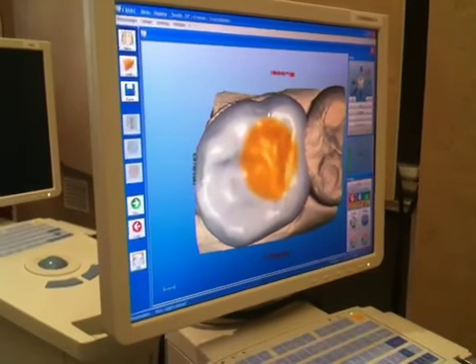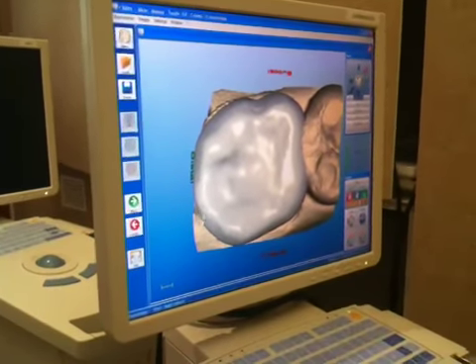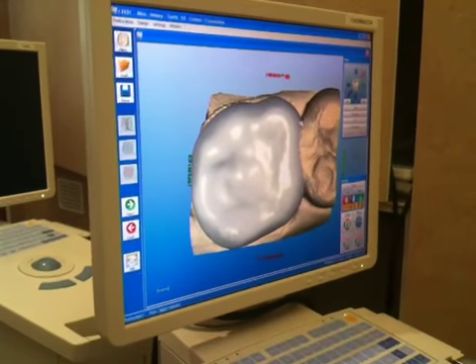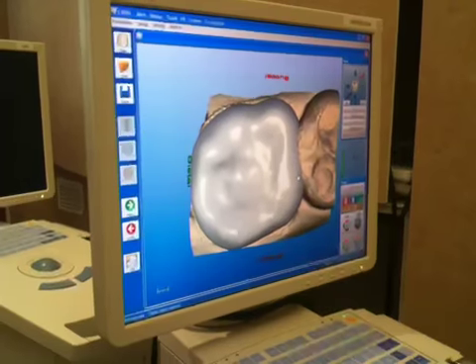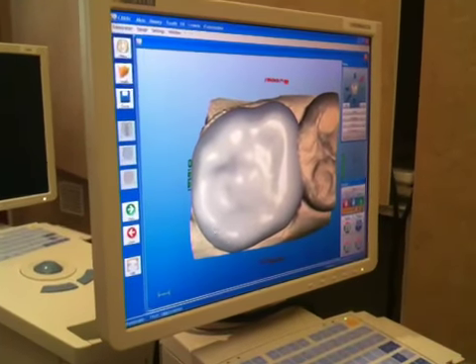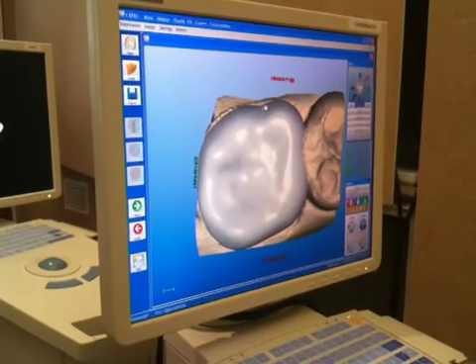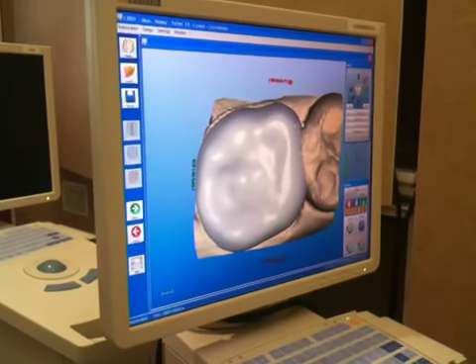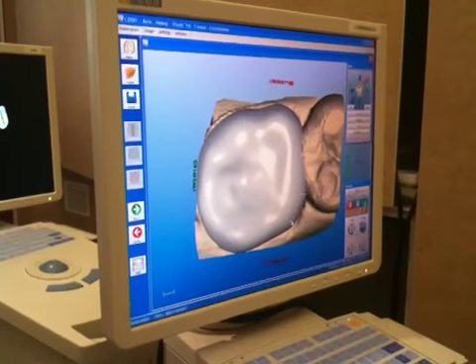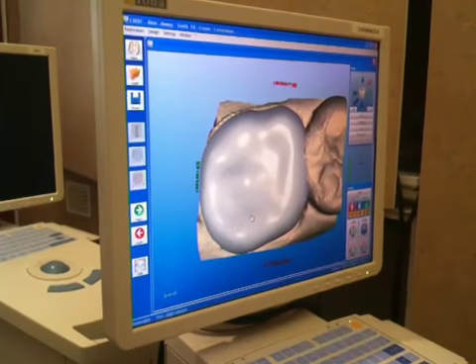So now this yellow area just tells me how big of an area I'm going to be adjusting at once. And now what you're seeing in front of your eyes is that I'm smoothing the tooth off. You notice that it looks like it's enveloping a portion of this other tooth, which just basically means that we haven't gone into it too much, and we're going to be solving that issue as well right now. So again, I'm just reshaping the tooth a little bit here, getting rid of any marks that we do not like, smoothing it out.